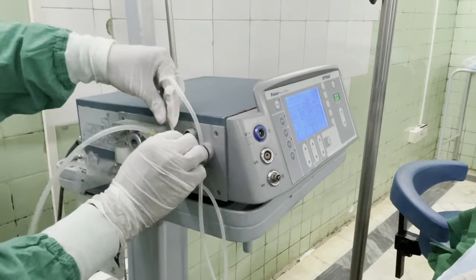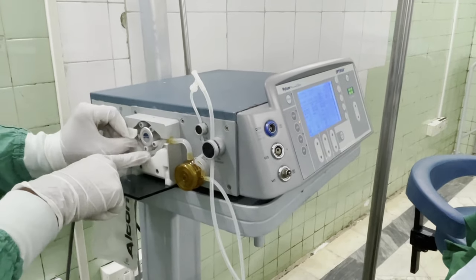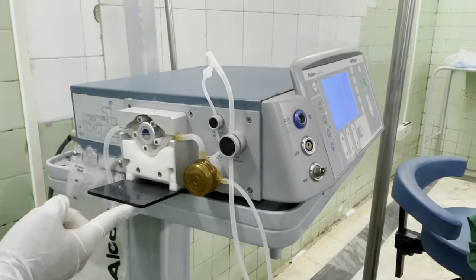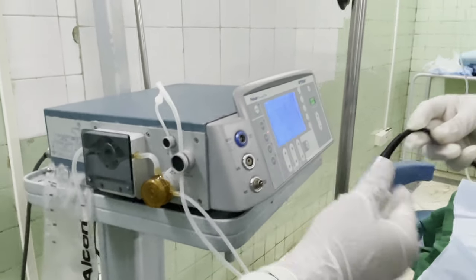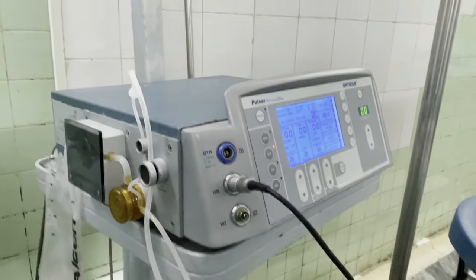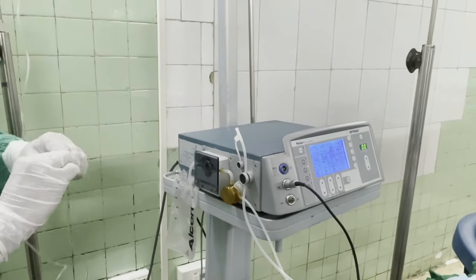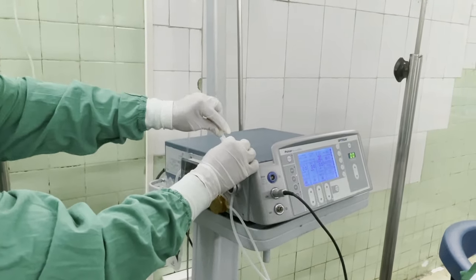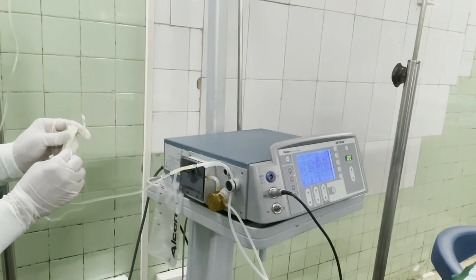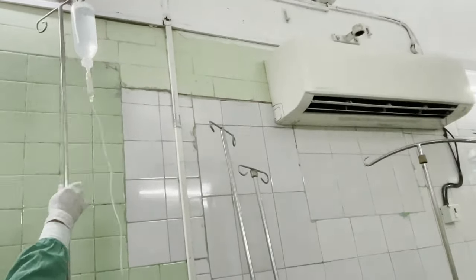All the various tubings and the cassette are snapped into their correct position. Once the nurse gives the distal end of the sterile tubings to the assistant, one end of it is then connected to the bag which holds the aspiration fluid. The electric connection is then established. The infusion from the bottle is then connected to the infusion tubing. It is then turned on after we have already primed it in the past. The bottle is raised to the desired height for the particular case.